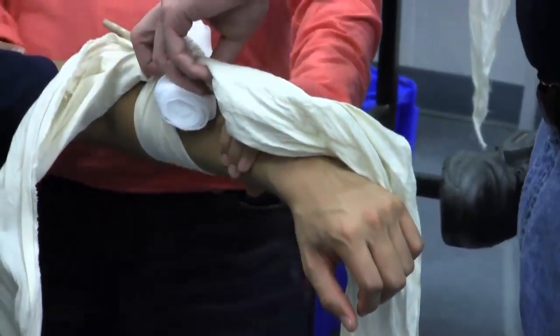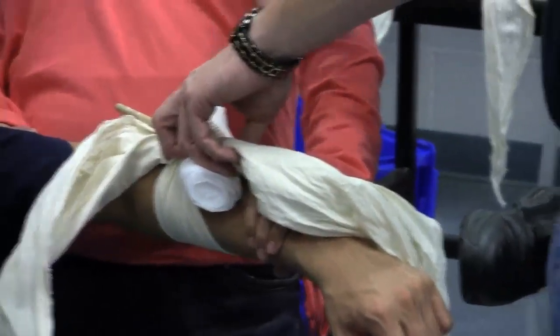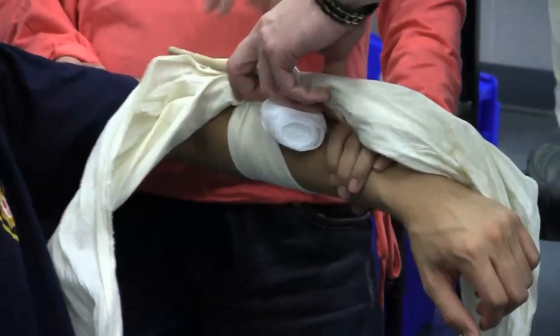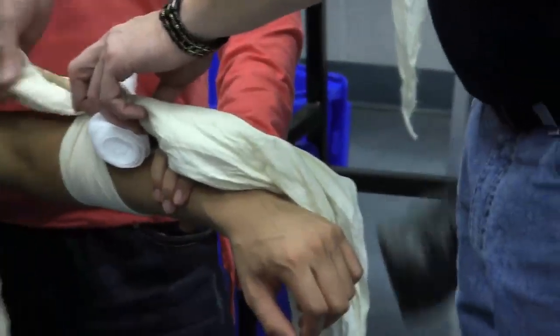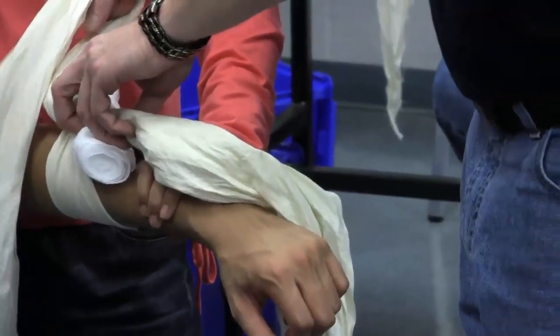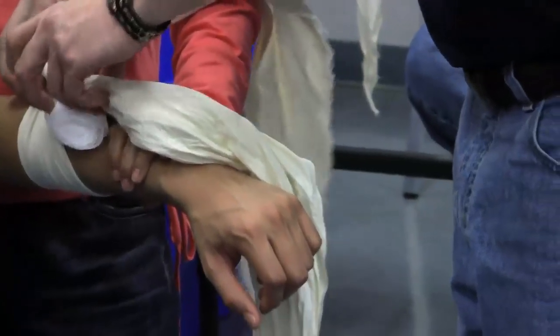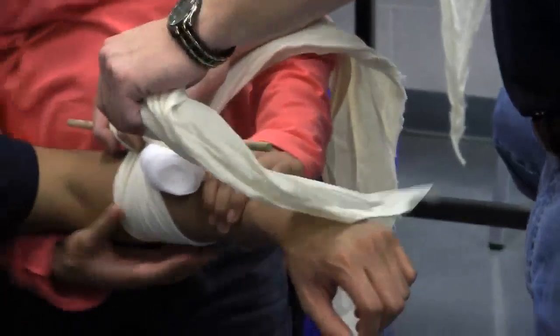Hopefully the bleeding has already stopped with initially putting the cravat around. What we're doing is just taking that last little bit and securing it the rest of the way. With your tails on the cravat, take these a little round — about eight or ten inches maybe. How do you know how far? Until it stops bleeding.